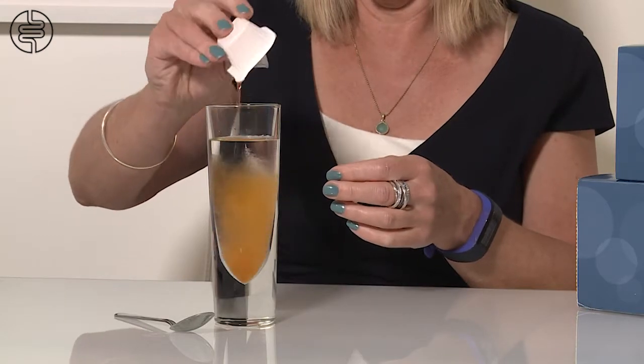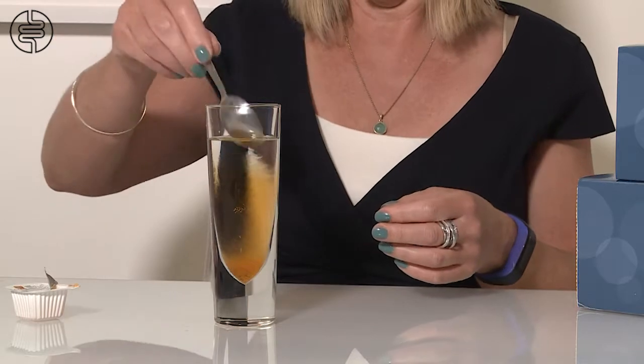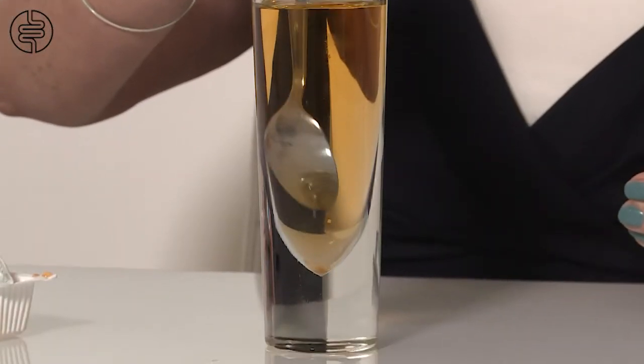After you have collected your baseline control sample, you need to mix and drink the lactulose or glucose solution, then wait 20 minutes before your next breath sample. Continue to collect samples every 20 minutes until all of the tubes are used up. This will take three hours. Be sure to write the date and time on the labels as you go along and attach them to the tubes.